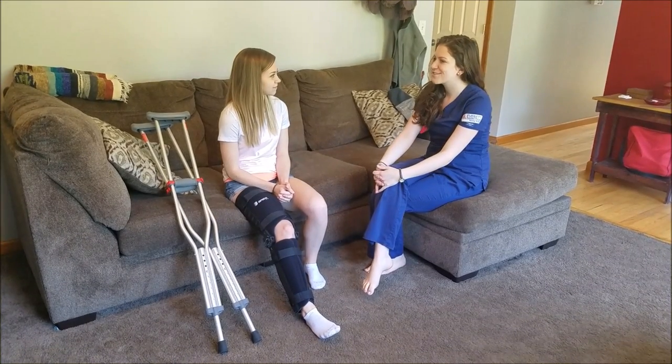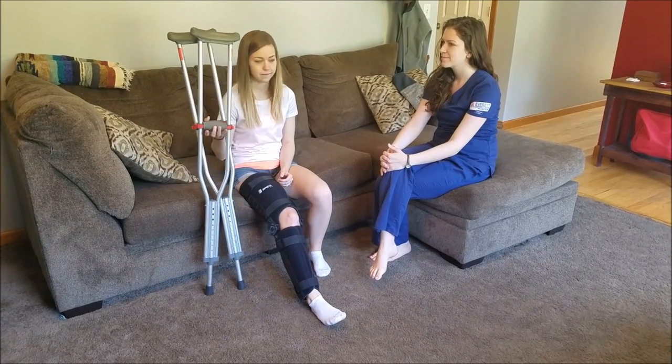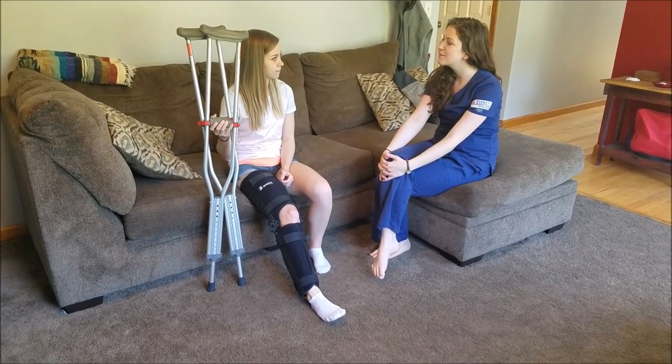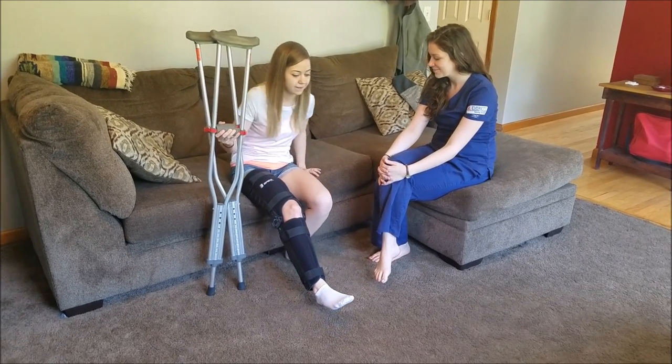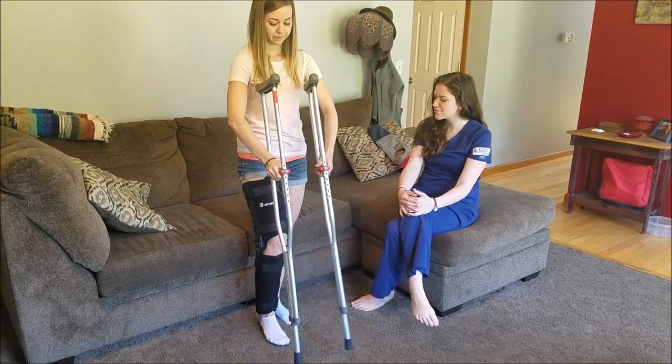Place both crutches in the hand that's on the injured side. Push off from the chair with the free arm and use the good leg to stand. Once upright, place the crutches under each arm.